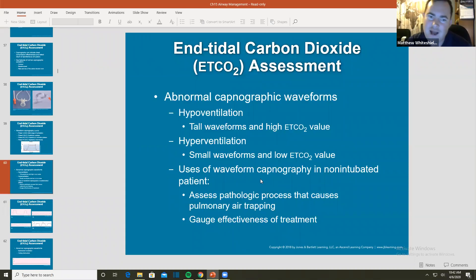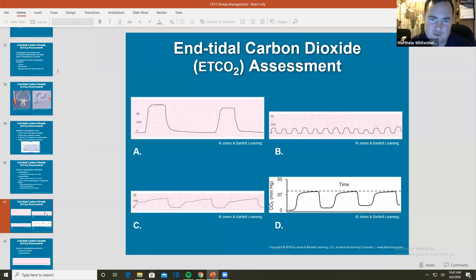Next one, hyperventilation. Small waveforms, low end-tidal. So if I see very small end-tidals and the space in between each one is very short, like this, we know hyperventilation.